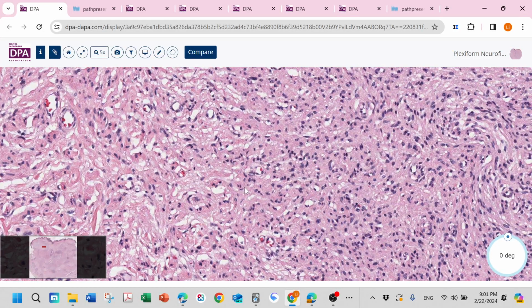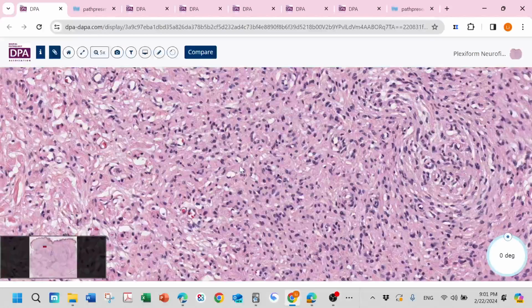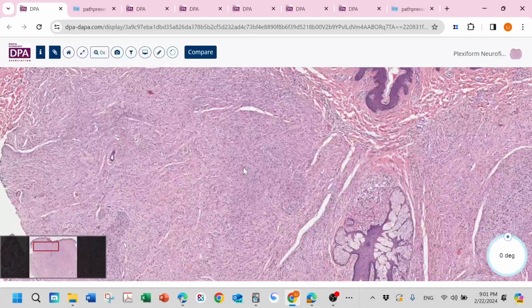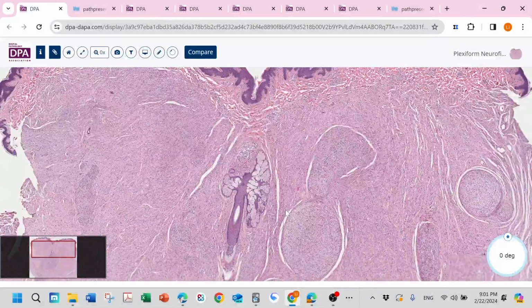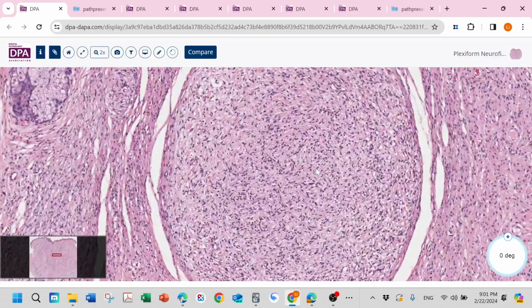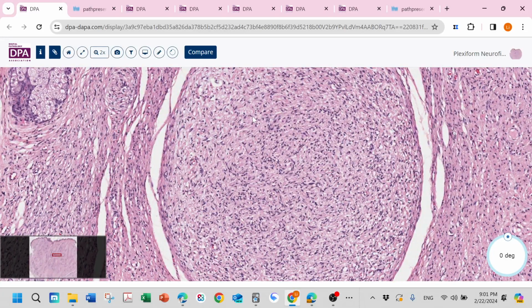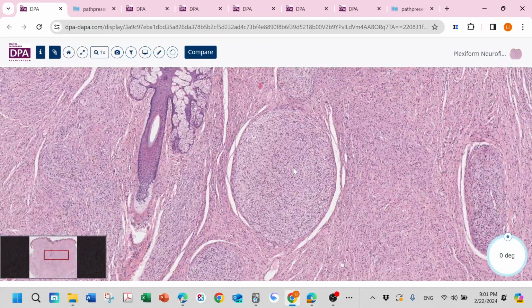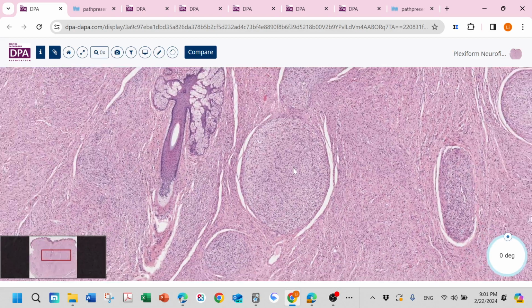because we know there are three populations in the neurofibroma. So no doubt to diagnose neurofibroma. How about this area? Kind of well demarcated, but they are still identical, looks like neurofibroma. So when we see this structure, we are highly suspicious for so-called plexiform neurofibroma.